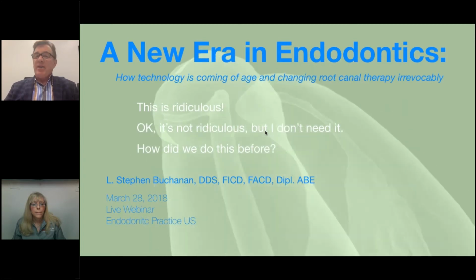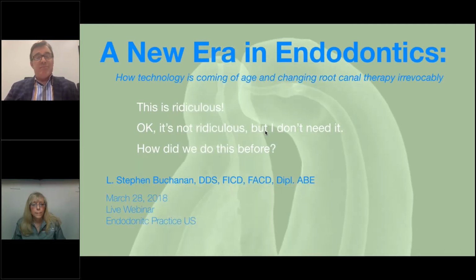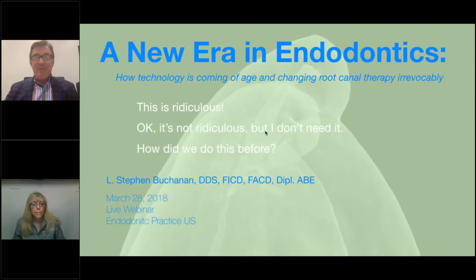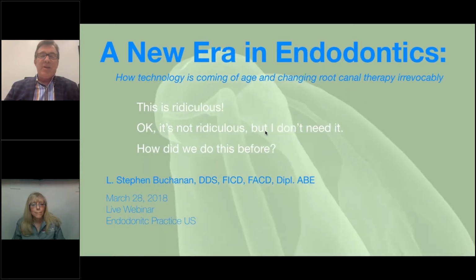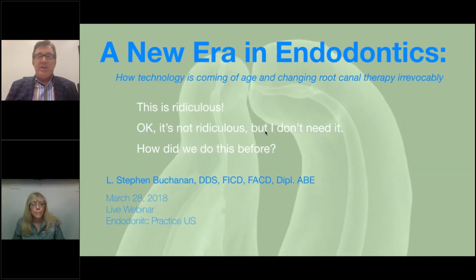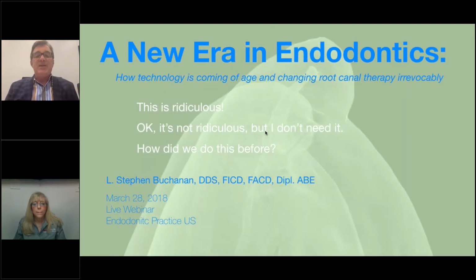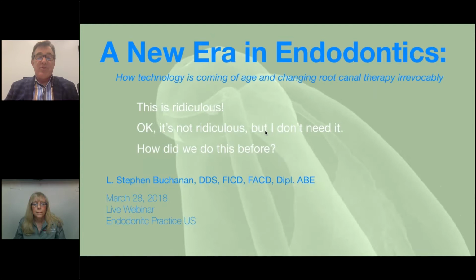In today's day of popularity of implants, people who do endodontics especially, we need to build a case that this tooth is worth saving. It's got enough structural integrity after root canal therapy to be not a temporary treatment plan for an implant, which is the implant surgeon joke, that we can make a smaller access, we can make a smaller coronal shape, because this cleaning capability is so tremendous. You don't need canal shapes like we did before when we used irrigating cannulas. We just need to clear a path to the root canal, so we know there's no calcific obstructions, and gentle wave will do all the rest of the cleaning.